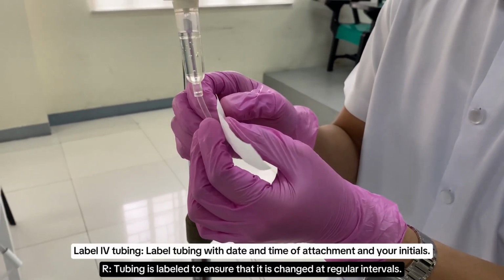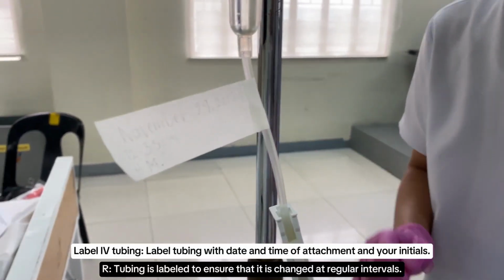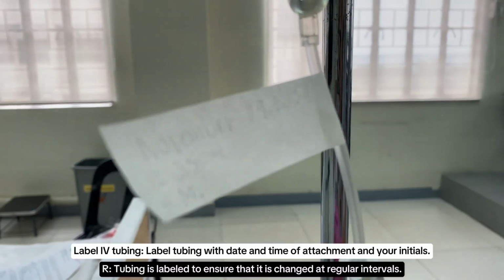Label IV tubing with the date and time of attachment and your initials. Tubing is labeled to ensure that it is changed at regular intervals.